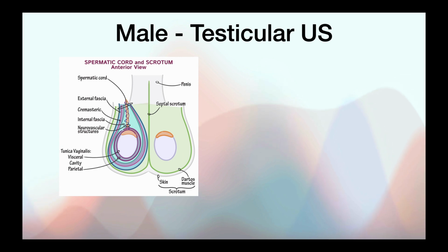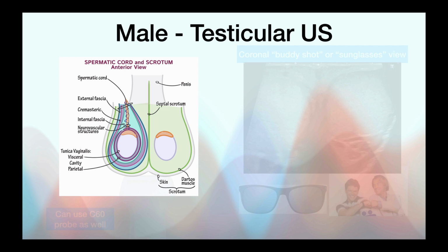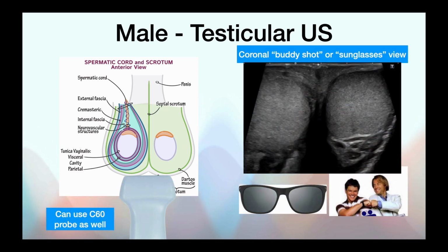Now let's move on to the scrotal and testicular structures. For the first ultrasound window, the patient is laying supine, and a towel is placed underneath the scrotum to elevate it. A linear or curvilinear probe is placed in the coronal plane, indicator pointed to the patient's right, and the scan plane is pointed superiorly, as you see here.